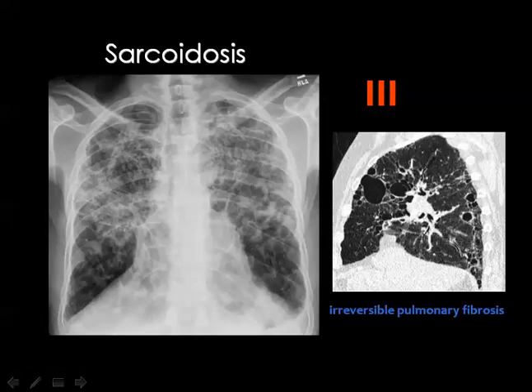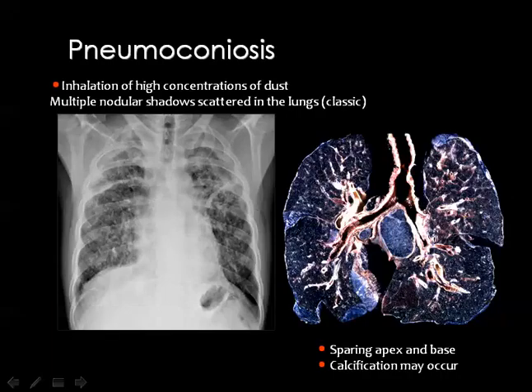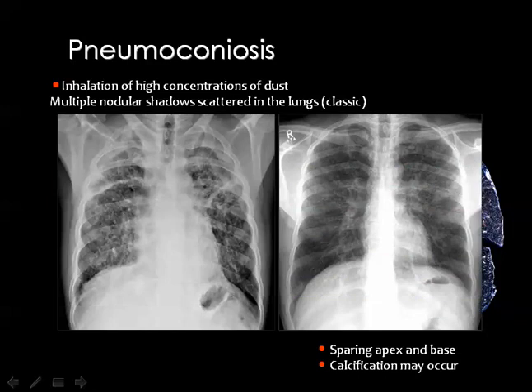Then at the end stage of sarcoid, you got opacities similar to irreversible pulmonary fibrosis, traction bronchiectasis, honeycombing, and areas of air trapping and emphysematous bullae. This is what is known as end stage lung. And pneumoconiosis means that you are dealing with opacities in the lung secondary to working in industrial projects, for example, and you got the miliary shadows in the lung, which are very dense because of the composition of the nodules. And you can compare the density of miliary TB nodules with the density of pneumoconiosis nodules. Nodules of pneumoconiosis are very dense, and nodules of miliary TB are usually soft.